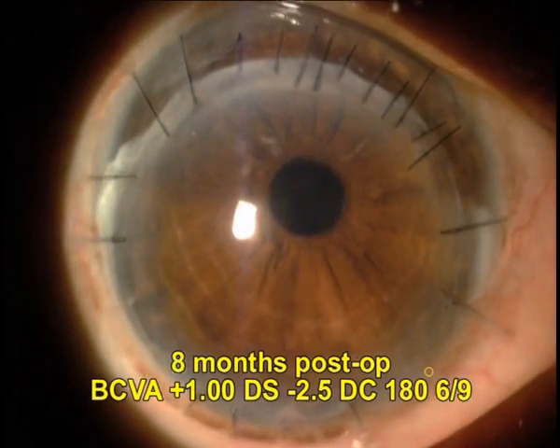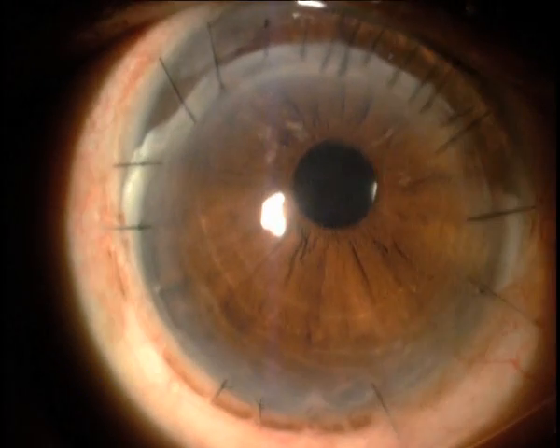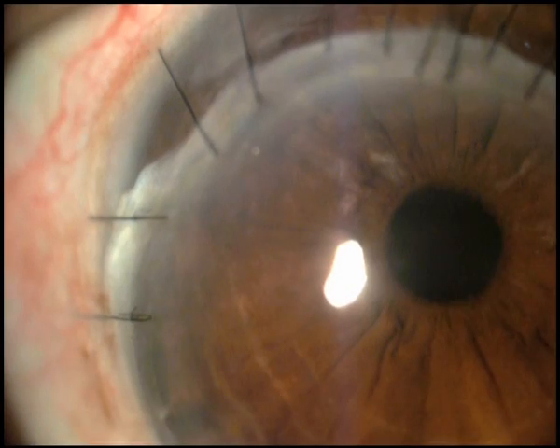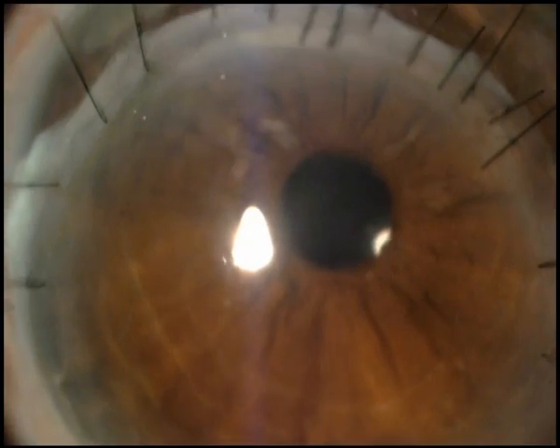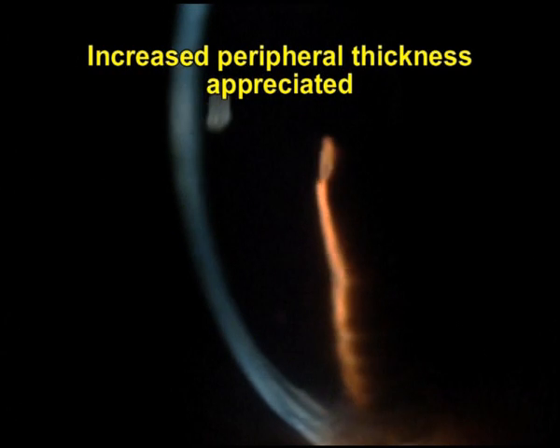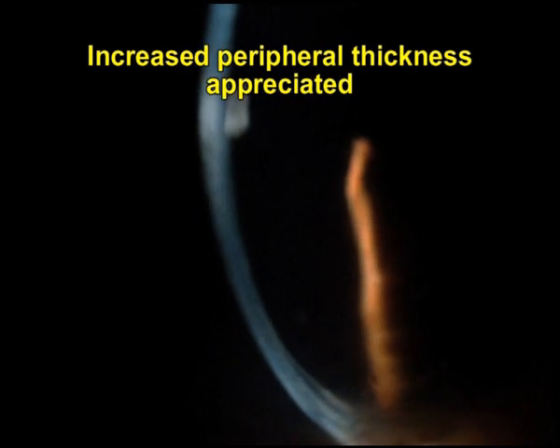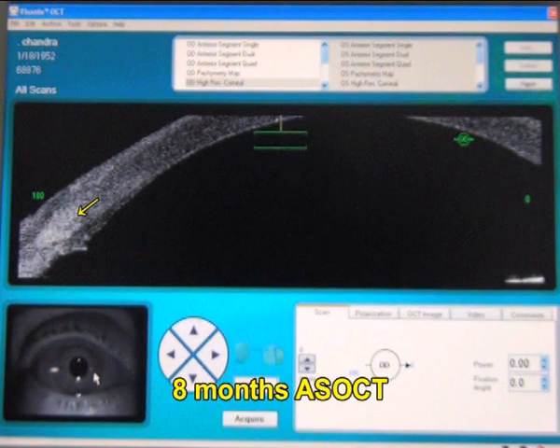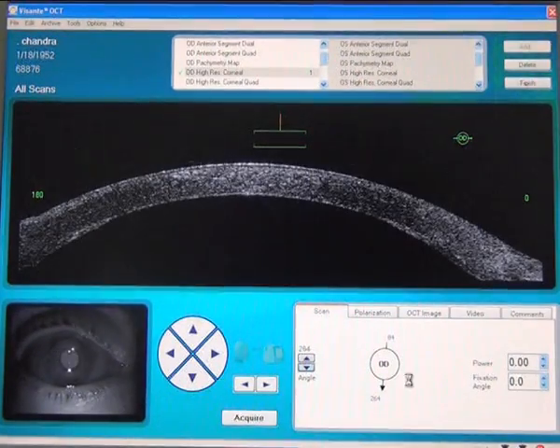The eight-month appearance of the patient shows a best corrected visual acuity of 6 by 9 with just a minus 2.5 diopter cylinder, which is a gross improvement and the patient was extremely happy with the results. You can see the cornea is very clear and the peripheral skirt of tucked-in tissue is seen, showing the increased corneal thickness gained in the peripheral cornea. This increased skirt of tissue goes all around the inferior 180 degrees, and the eight-month post-operative anterior segment OCT also shows the tucked-in bit of tissue which aids in increasing corneal thickness.